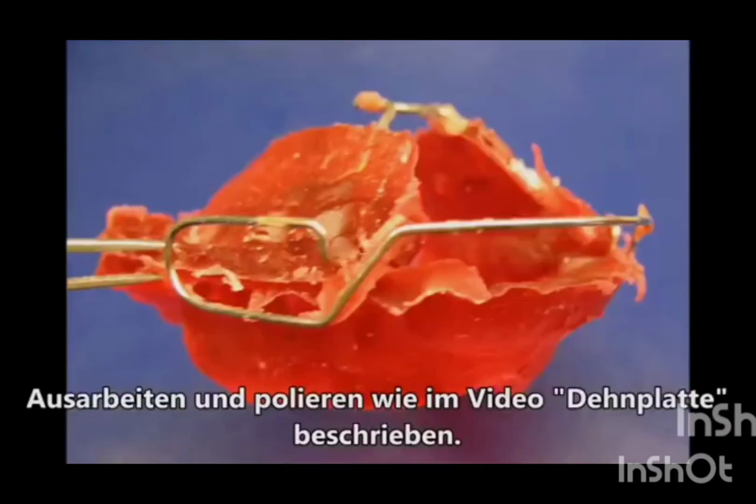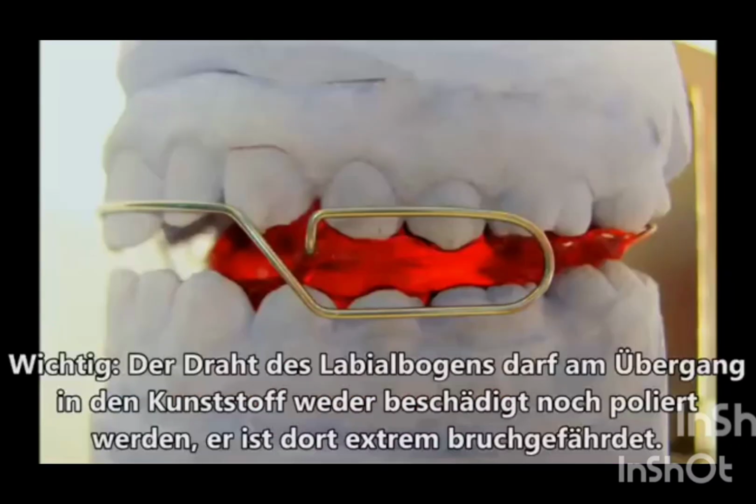This is the acrylization. This is how it comes out, and after polishing and polishing, this is the completed bionator.